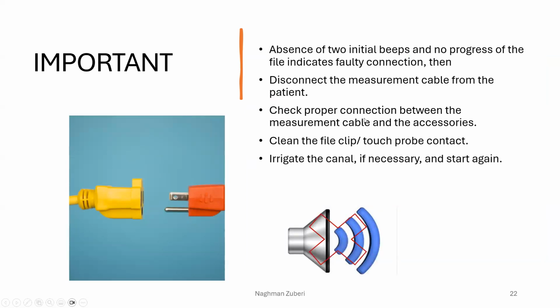Absence of the two initial beeps and no progress of the file indicates faulty connection. Check the connection. Disconnect the measurement cable from the patient. Check proper connection between the measurement cable and the accessories. Clean the file clip and touch probe contact, and irrigate the canal if required.